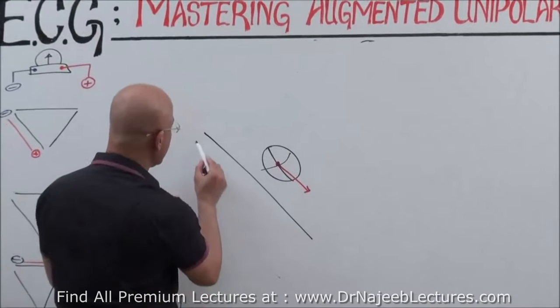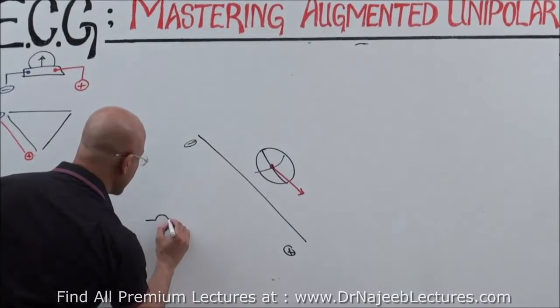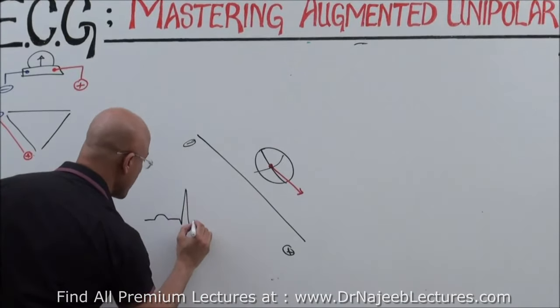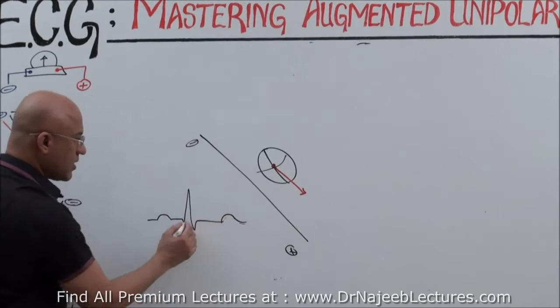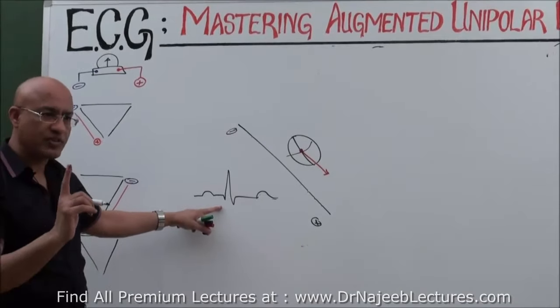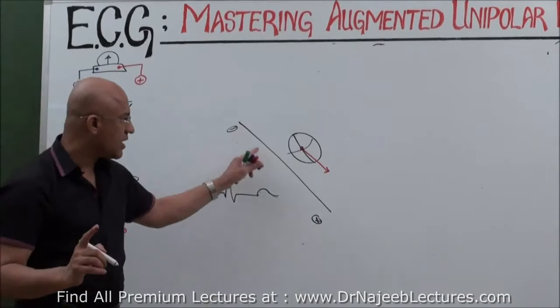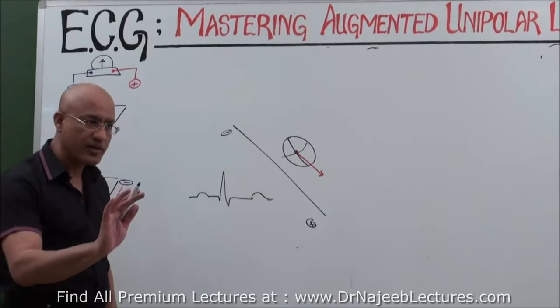Now, if you detect, this is lead number 2. So the ECG pattern will come like that. Is that right? This I have explained in the very first lecture of ECG, basics of ECG. In this lead the PQRST complex comes like that, right?